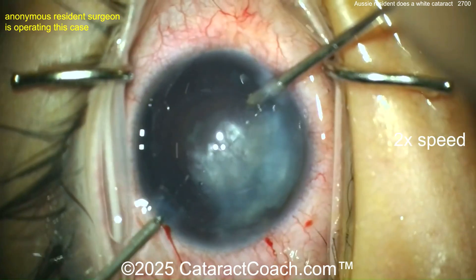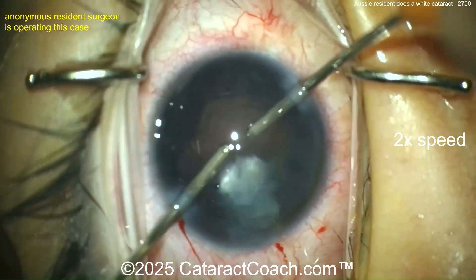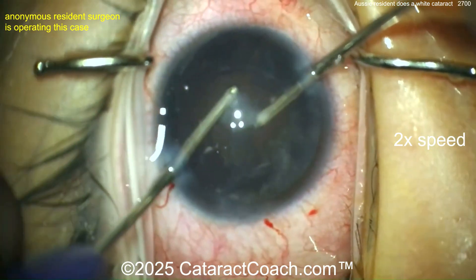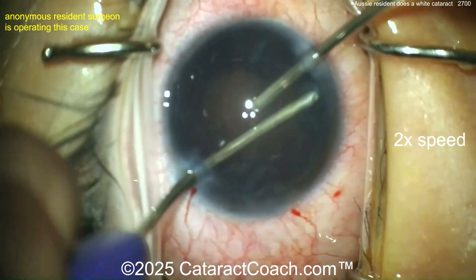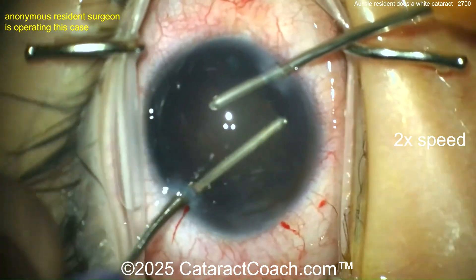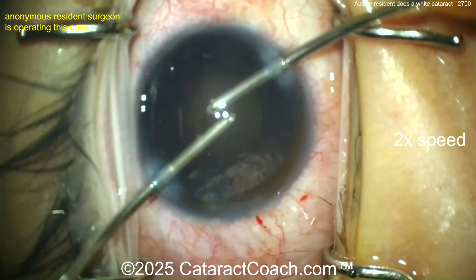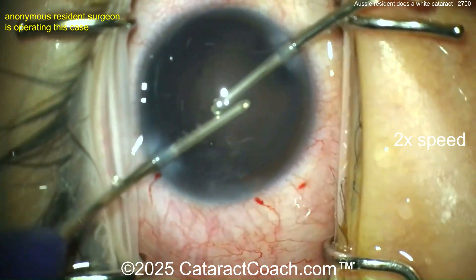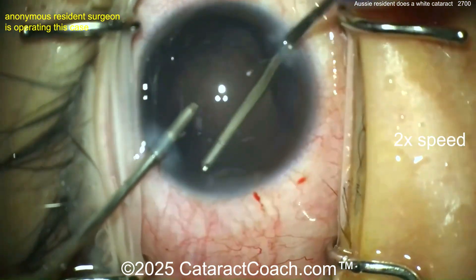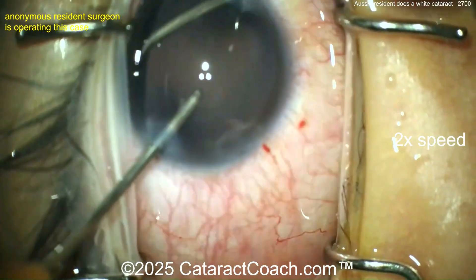Switching hands here with the bimanual IA, cleaning up that lens cortex — let some light get onto that retina finally. That's a nice cleaned-up looking eye, fantastic. Hard to see exactly what we're polishing up here, but sometimes these white cataracts you can get some lens material stuck. There's some sub-incisional cortex for sure. Good job switching hands. These white cataracts can sometimes leave a little haze or scarring on the back — that's okay. Get the lens in, clean it up. Especially if you're a resident who's only done 300 cases, you can always do a YAG capsulotomy later. In our clinics, first-year residents — the newbies — were assigned to do the YAG capsulotomies so you can learn how to do that.